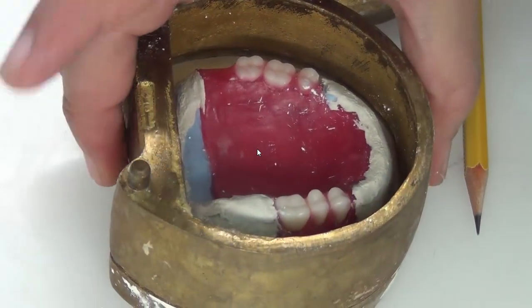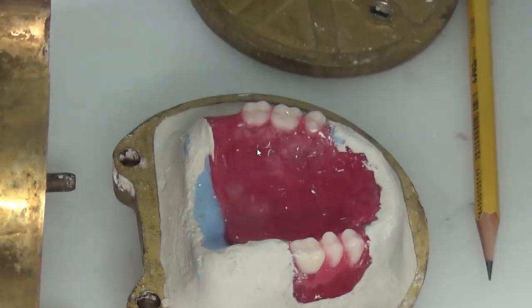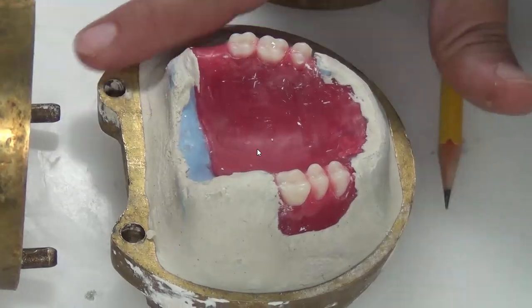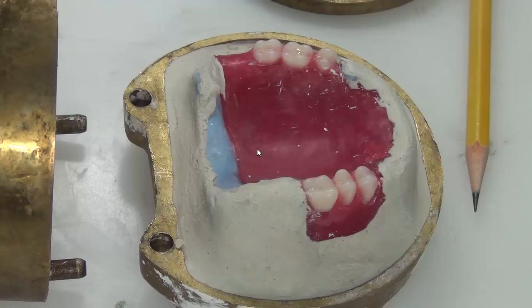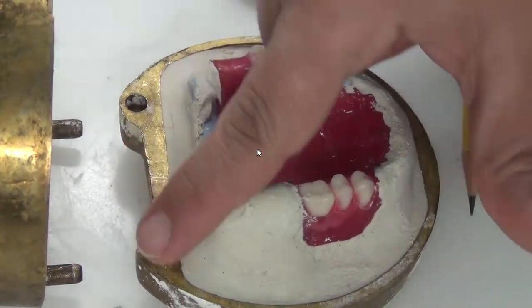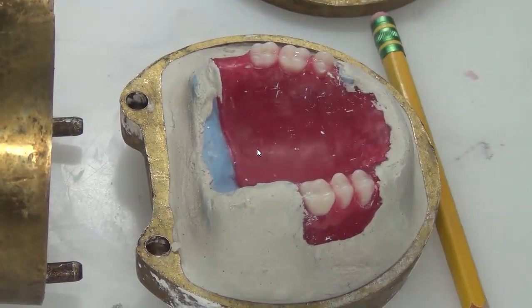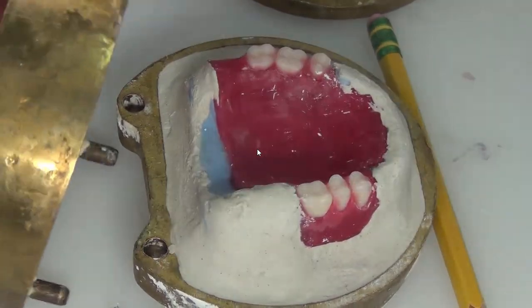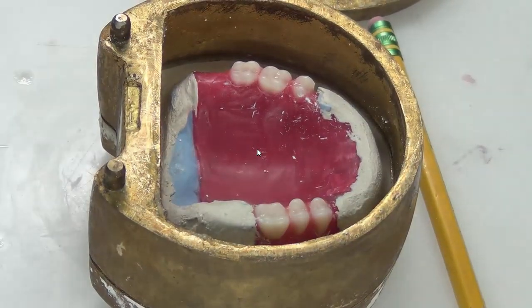So we want to make sure that this fits. Once we make sure it fits, then it's ready for the second layer of Vaseline. We put Vaseline all over the lower member with the rims, with the plaster, everything except the wax. Now we separate all parts of the lower flask with Vaseline except the teeth and the wax. Okay, these we don't put any Vaseline on. We'll also put Vaseline on the upper member and then put it into location. Okay, fix it into location.